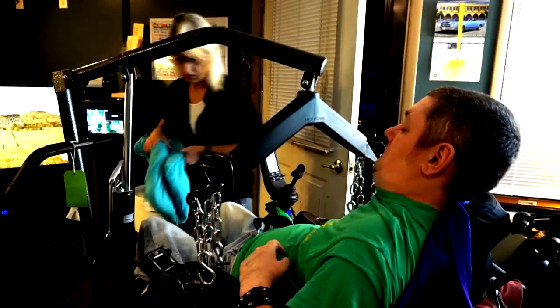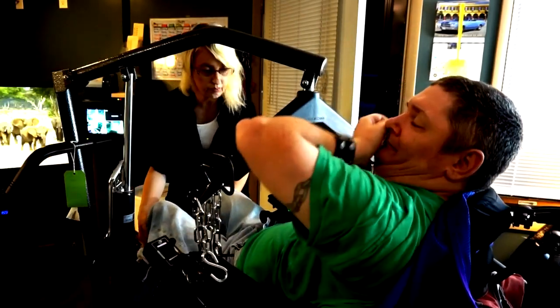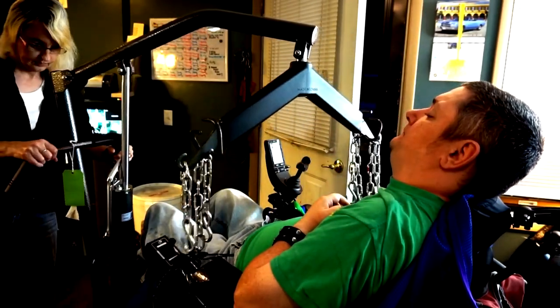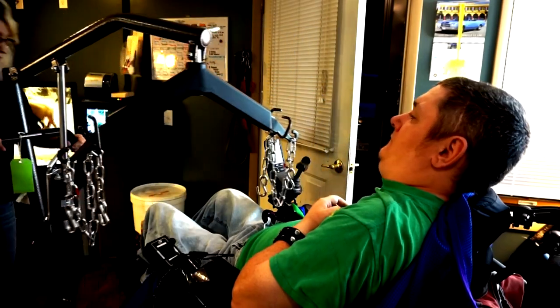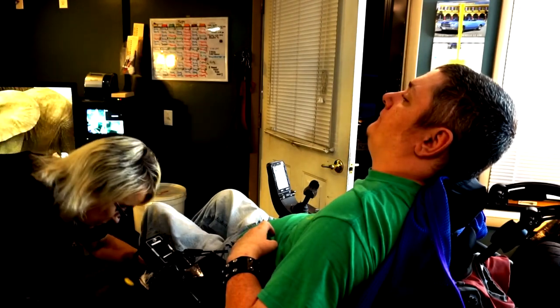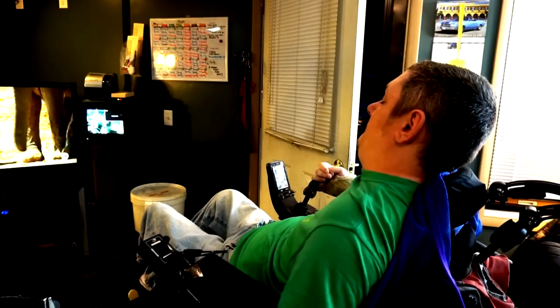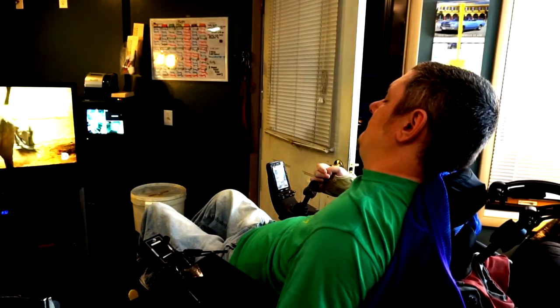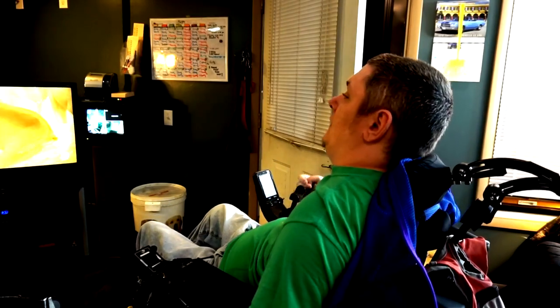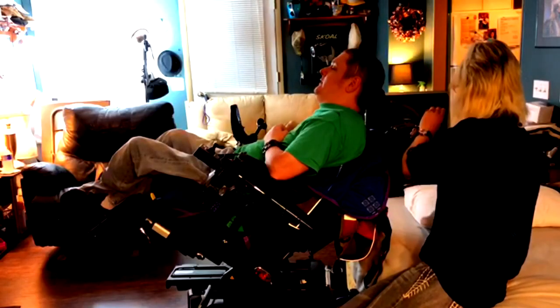I remove the knee pillow, pull the Hoyer away, throw my footplate on, and then what I do is pull up to the bed or the couch. I also make a headrest adjustment there.